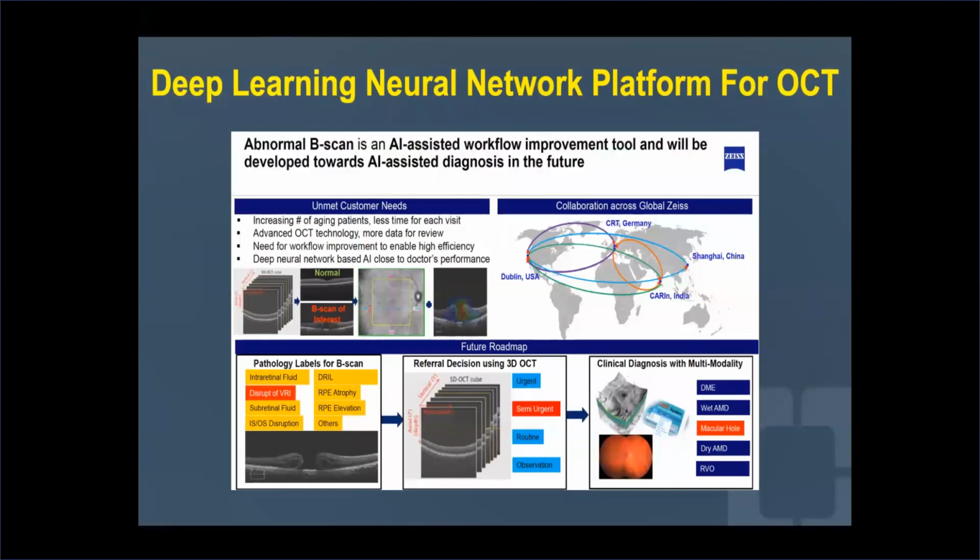And what we're doing now, based upon that, is developing some algorithms for decision pathways so that the clinician or the optometrist or even maybe a technician will know what to do with the urgency of this. And eventually it will then give back a diagnosis of any of these disease states, but that's something we're teaching the model to learn over time. So this will hopefully come in a newest version of the ZEISS software. We're working actively to get this out to users because it can be very helpful.